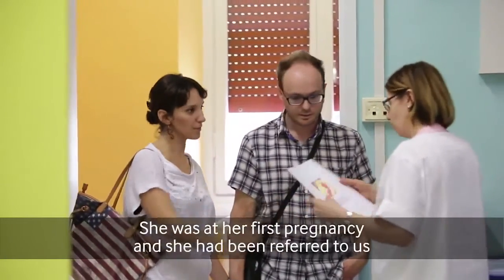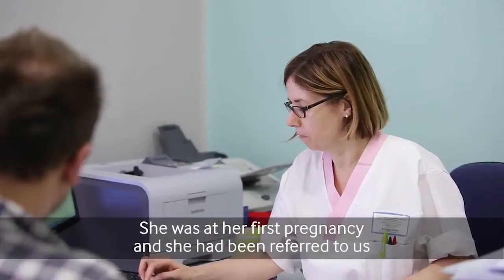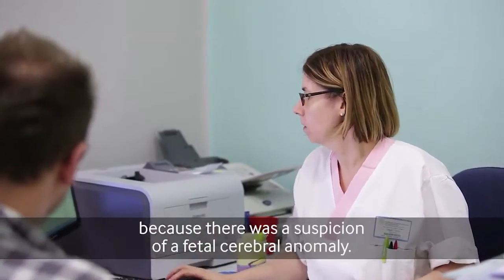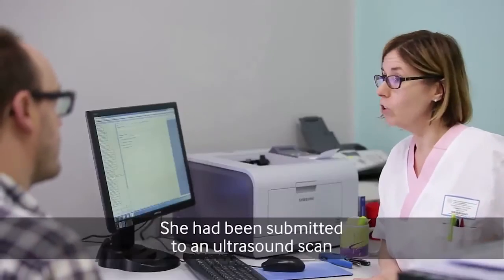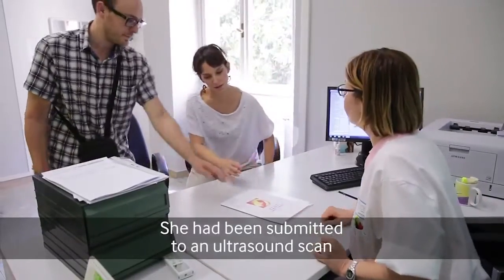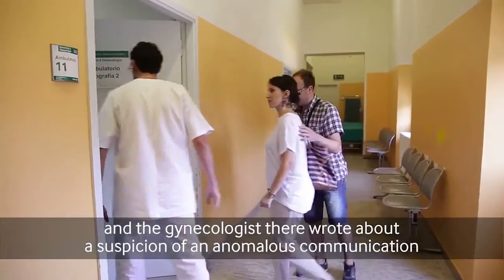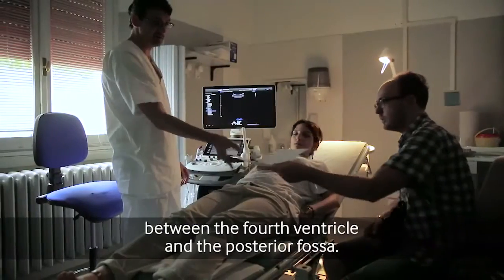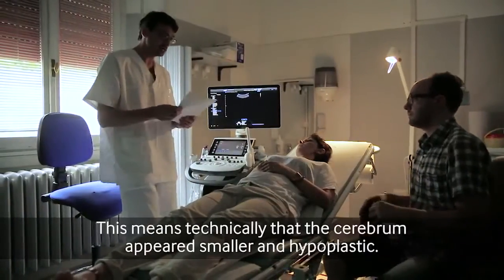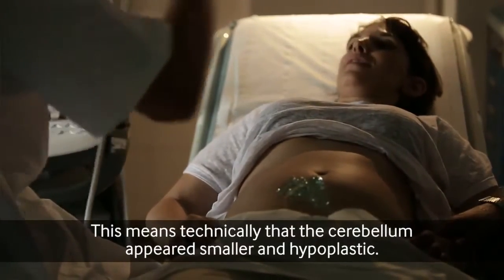She was a lady in her first pregnancy. She had been referred to us because there was a suspicion of a fetal cerebral anomaly. She had been submitted to an ultrasound scan elsewhere, and a gynecologist there had raised the suspicion of an abnormal communication between the fourth ventricle and the posterior fossa. This means technically that the cerebellum appeared smaller and hypoplastic.